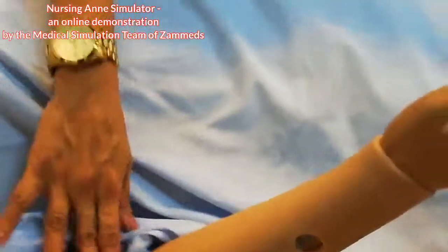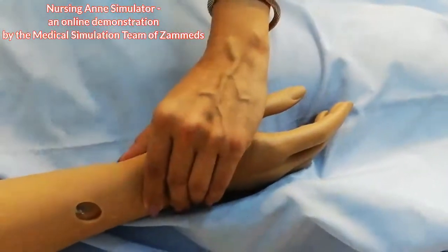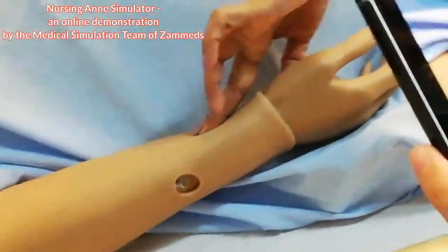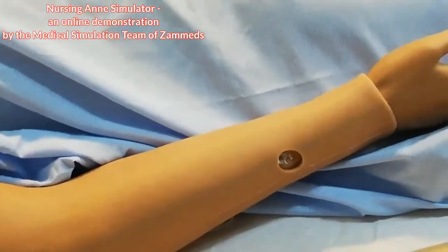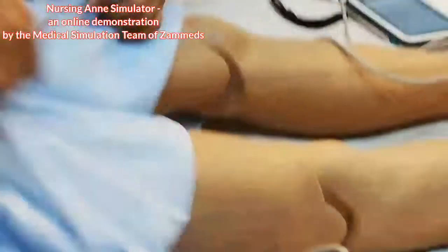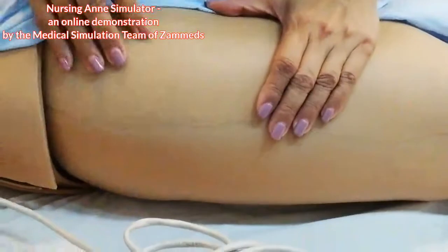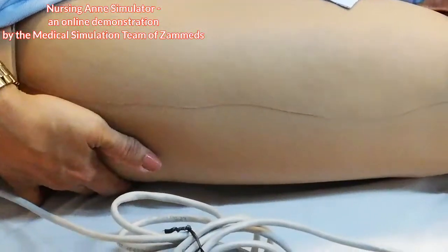Going down, she has radial — brachial, I should say — and then the radial pulse as well. She also has a femoral pulse on this side, and we can inject here at the femoral site.